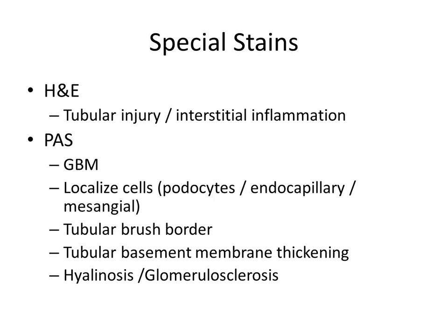So sometimes with the H&E, the podocyte cytoplasm kind of blends with the glomerular basement membrane, and then that blends with the mesangium, and there's just so much overlap that the PAS is going to help you kind of clarify it. Are you looking at podocyte cytoplasm? That's going to be paler than the GBM. Endocapillary cellularity is actually going to look like it's in a lumen. Mesangial hypercellularity is going to be within a matrix, in the mesangial matrix. So it's really going to help you localize where those cells are.